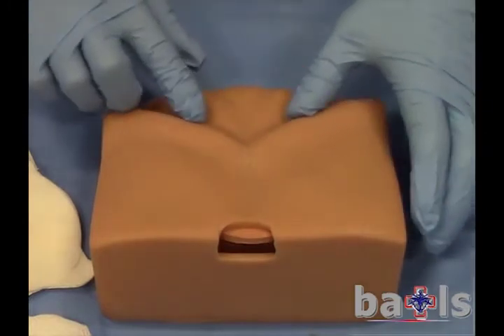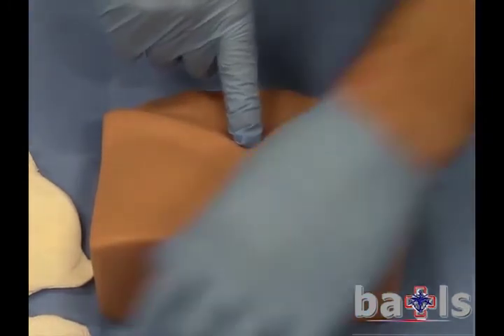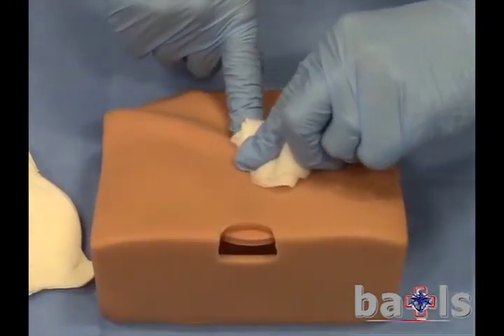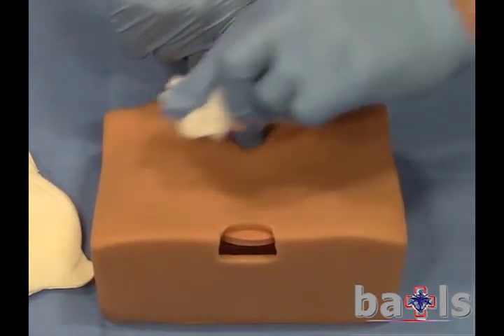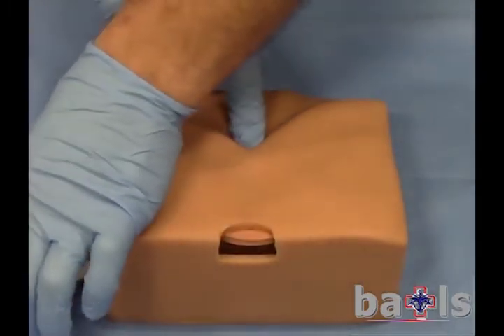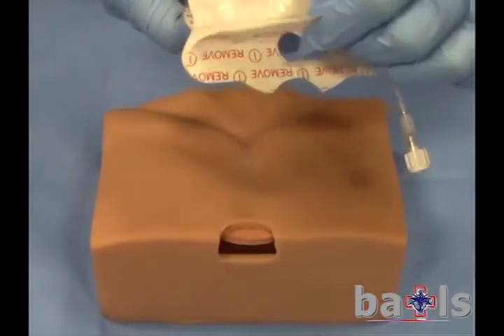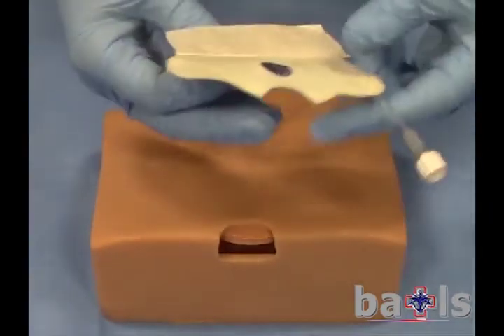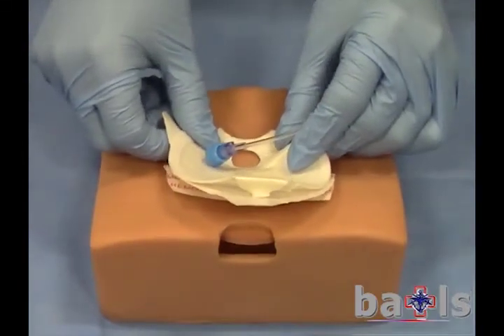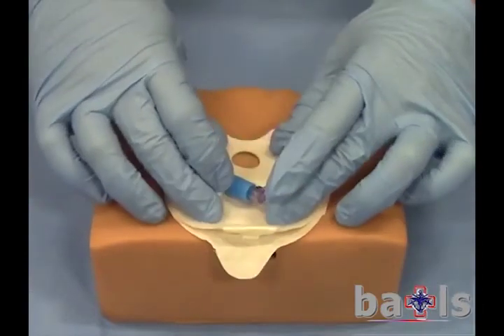Position yourself at the patient's head end and locate the sternal notch between the clavicles and above the sternum. Clean the site with an alcohol wipe. Then apply the target pad, lining up the sternal notch with the cut-out section.